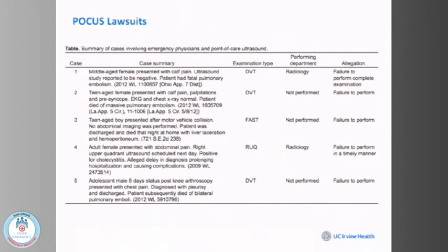So if the patient had a massive pulmonary embolism, there's a chance that they would have found clots somewhere, either in the IVC, which we do a lot for fluid assessment, where you breathe in and the IVC collapses, and also with a point-of-care ultrasound for DVT.